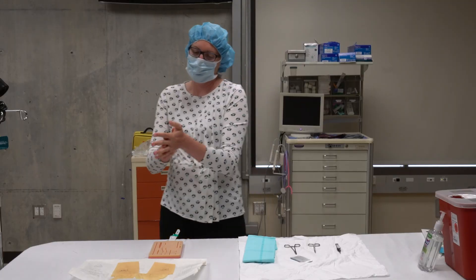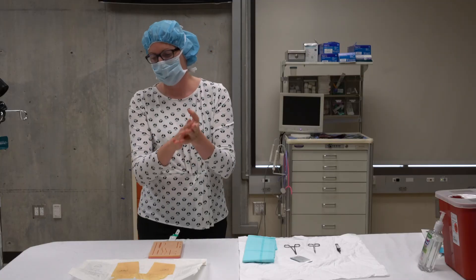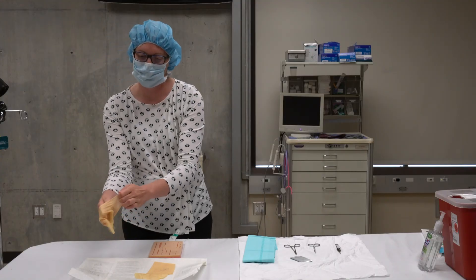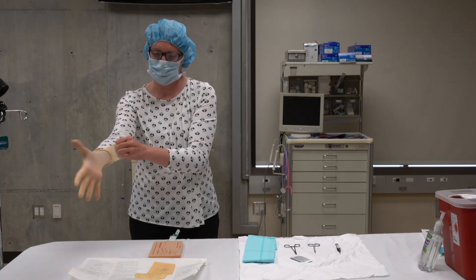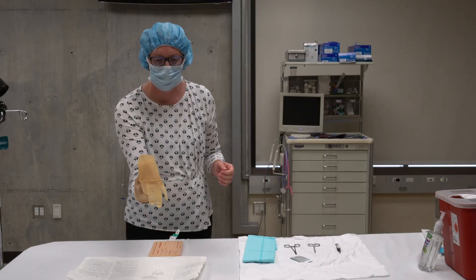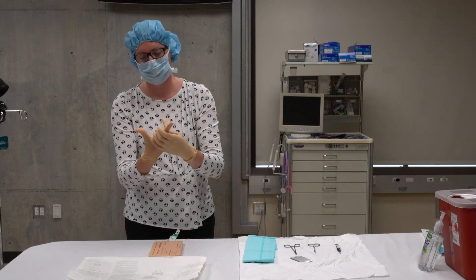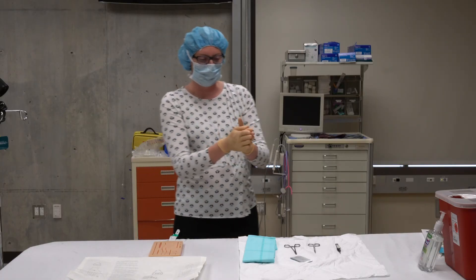Now that I've washed my hands I can put on my sterile gloves. I'm going to pick up one glove, place my fingers inside, then the other glove. Once I have these all on, I'm ready to begin my procedure.